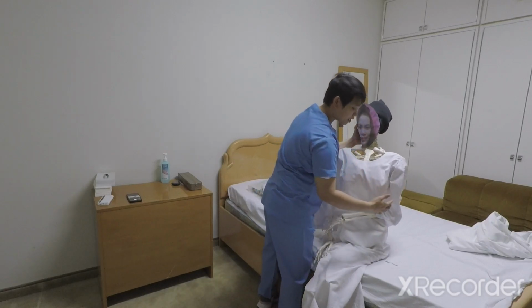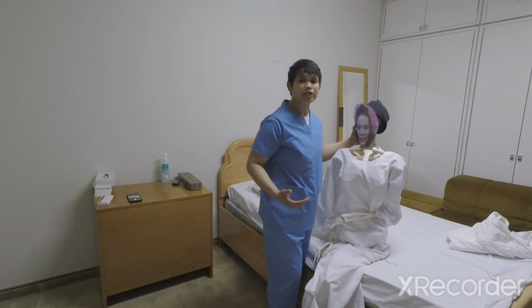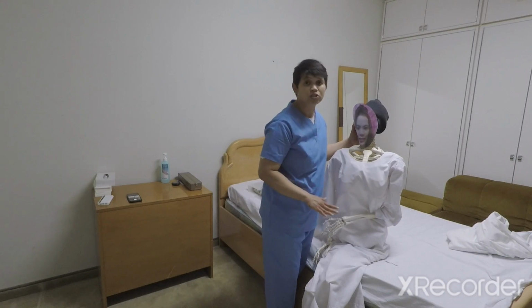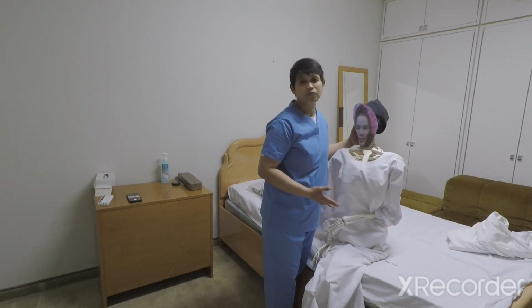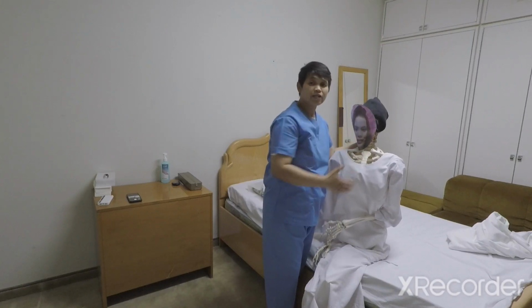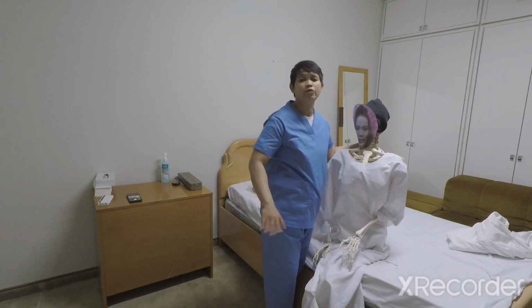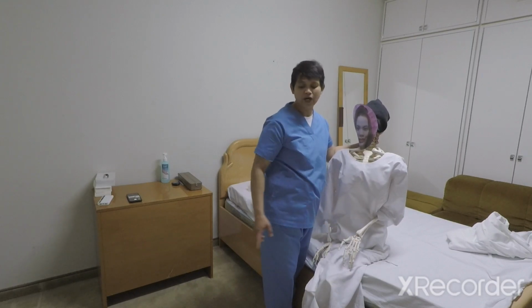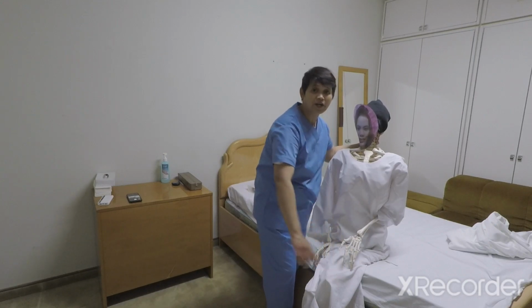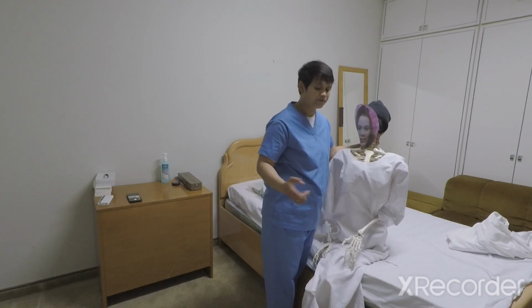When we do side lying, we have to ask the patient if she's feeling dizzy. If not, we can proceed in this position. Then again, we ask the patient if she's feeling dizzy. If not, we can continue to transfer into the chair or wheelchair. If it's a wheelchair, we have to be sure that the wheels are locked before transferring the patient to prevent the fall of the patient.